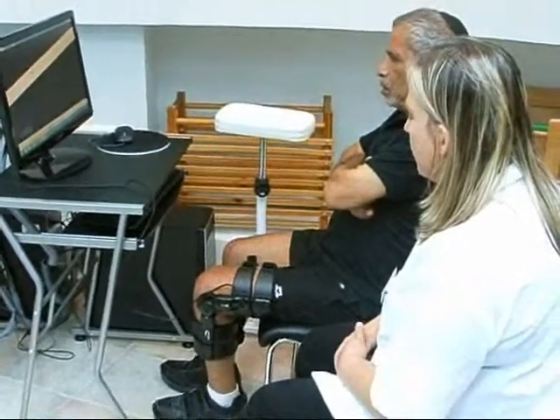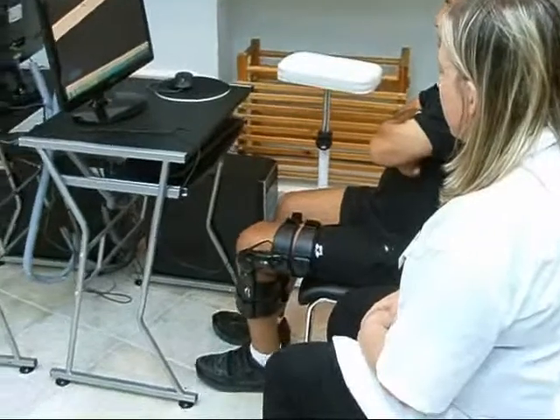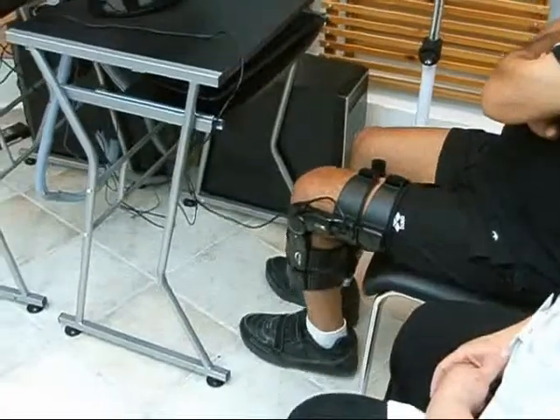The Leg Tutor is a wearable movement detection and motion feedback device that can sense knee extension and flexion as well as hip three-directional movement.